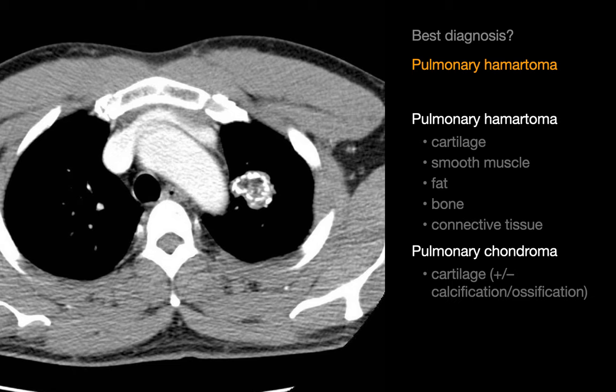Pulmonary hamartomas are benign neoplasms composed of cartilage, connective tissue, smooth muscle, fat, and bone. Pulmonary chondromas are benign neoplasms that consist entirely of cartilage with or without calcified or ossified components.